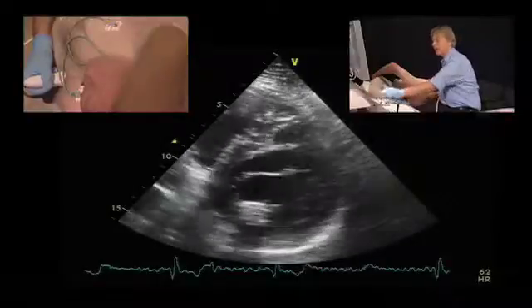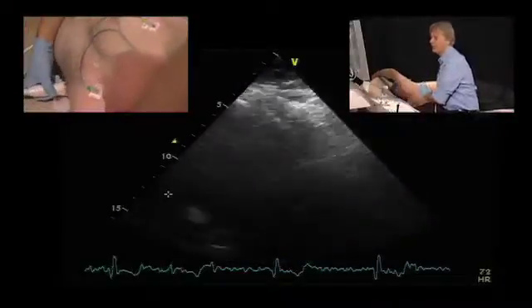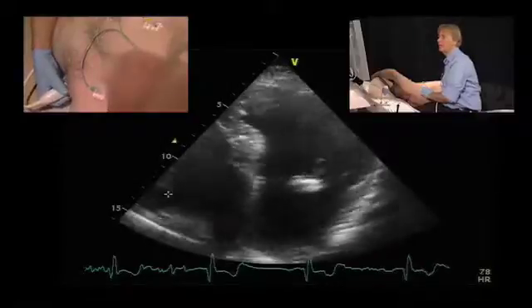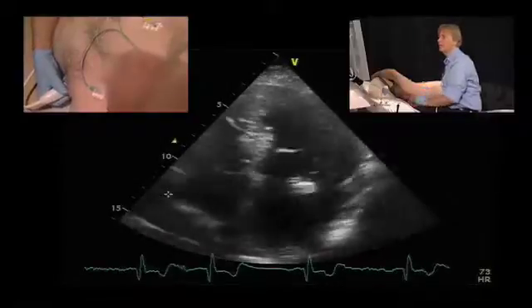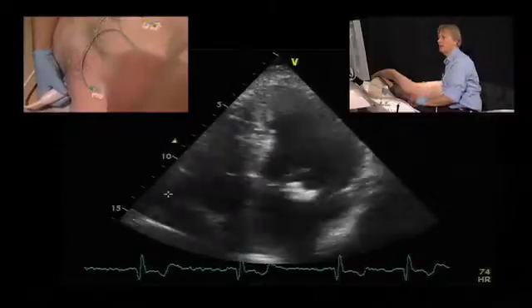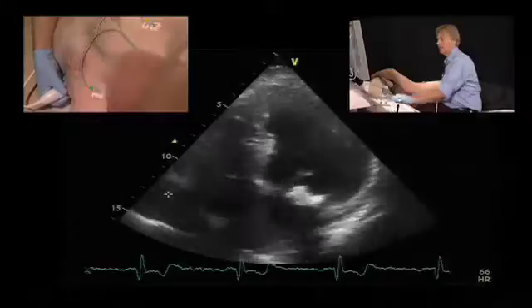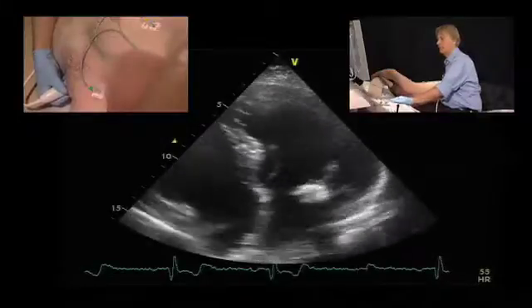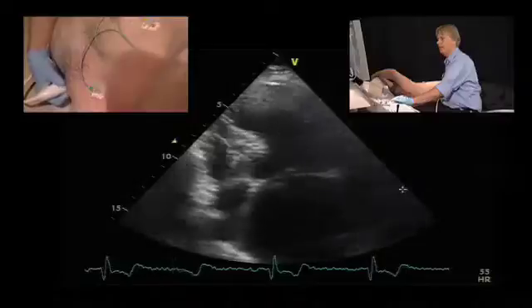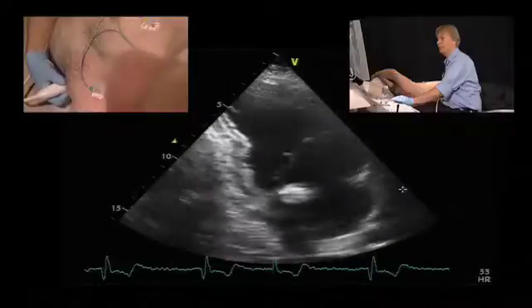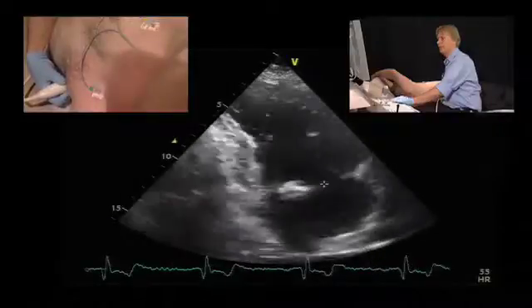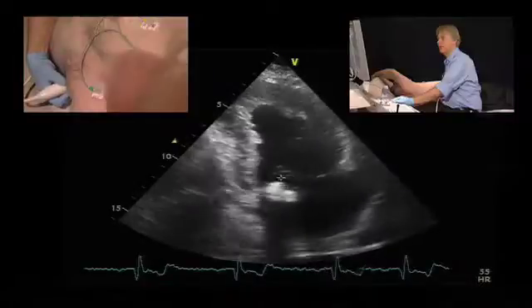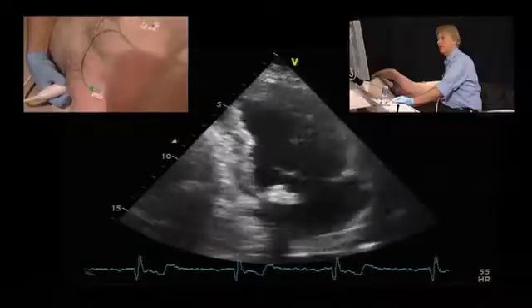To get a better appreciation we have to use the apical views as well. First, here is the four chamber view — again we see the structure in the region of the posterior leaflet right here. And in the two chamber view that fits very well with what we saw from the parasternal approach, here in the inferior region of the ring.